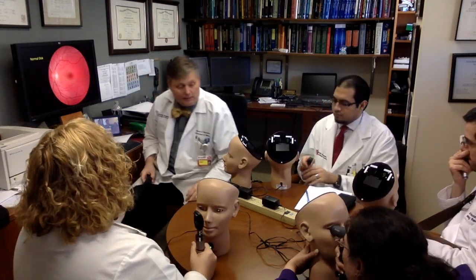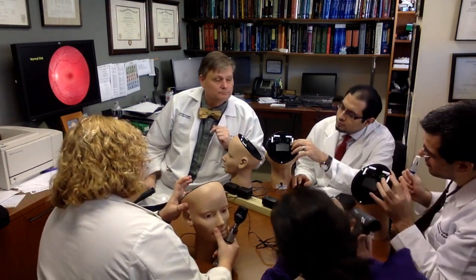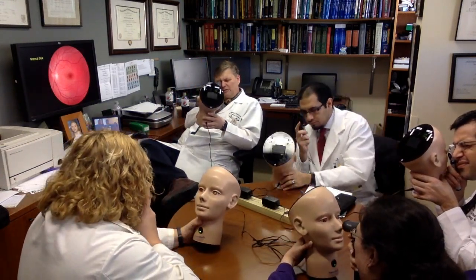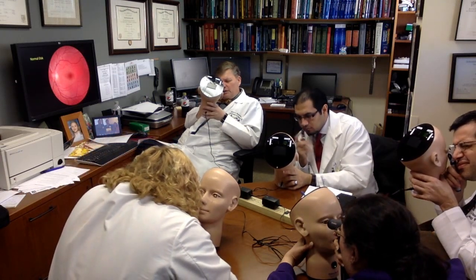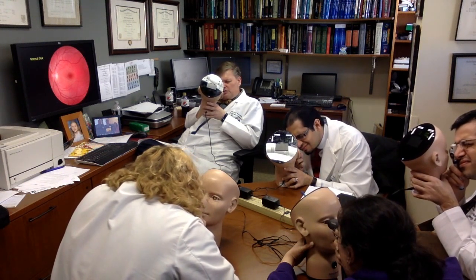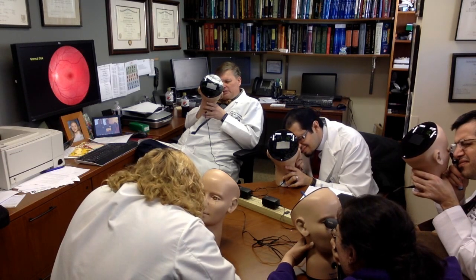Now, I'm going to have you turn to number 10. So go to number 10 here. So now, this will be the same story. Focus at a distance. And now, come in at 15 degrees. See your orange or red reflex. Come in closer, closer, closer. This is going to be kind of a blow up of the disc. And then focus very closely on the disc.